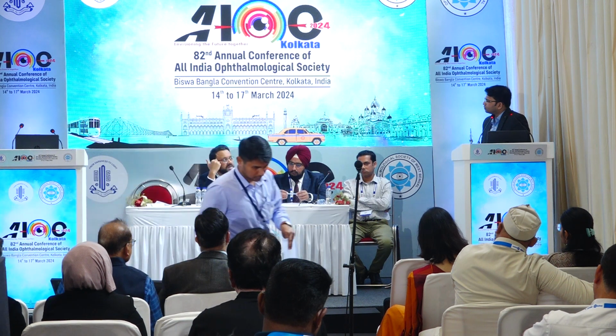My question is, what's your take on the use of 360 prophylactic laser barrage? Do you do it in your cases? I normally do not do it, and only if the media is not very good and you are not sure, then I may end up doing a 360 laser, but normally if the media permits, I do not do it.